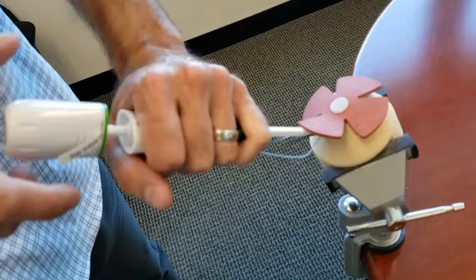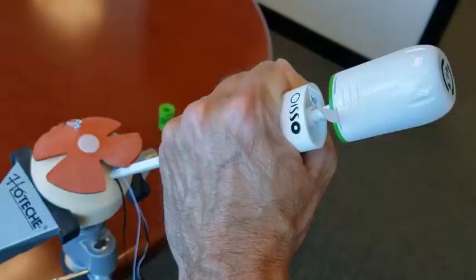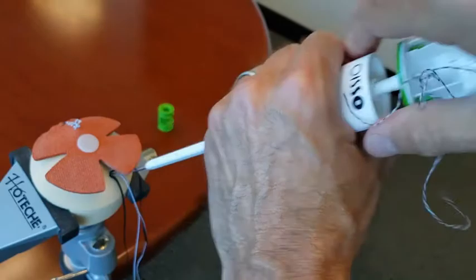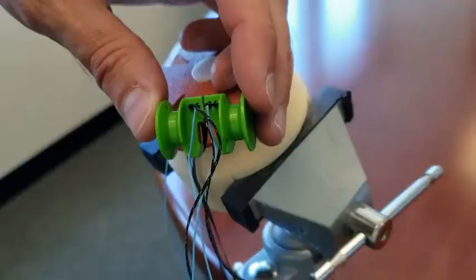You're going to bottom out once the white inserter reaches the surface of the bone. You can remove the suture cartridge yoyo, place the sutures out of the way, pull the pull tab to remove the stay suture and release the inserter. Now you can remove the internal stay suture.